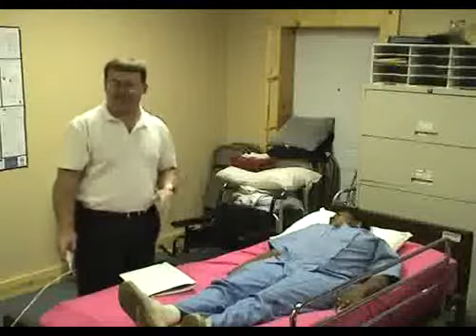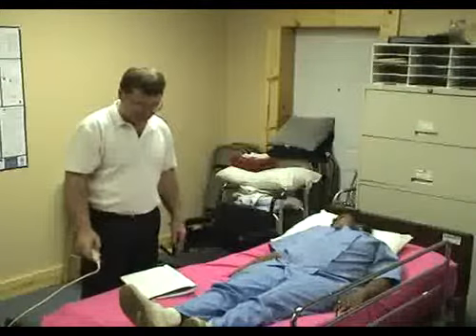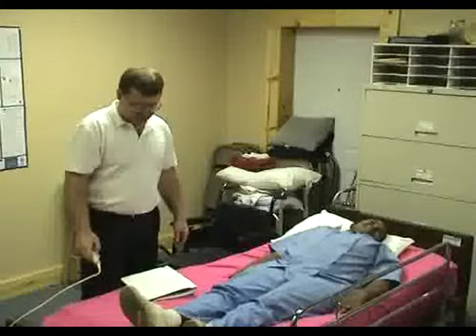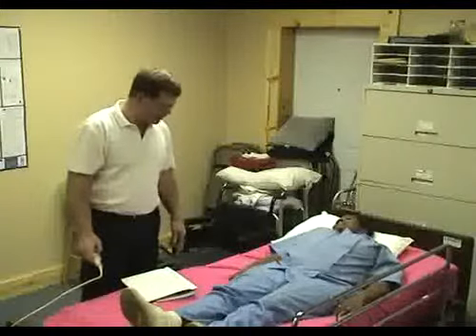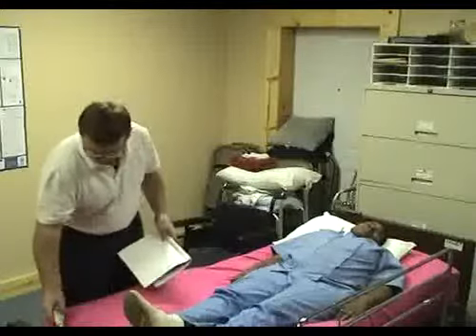Now the bed's up too high for me to be getting her in and out, so let me lower that down. Number 2. Moves client to the side of the bed next to the chair or wheelchair. Carmen already says she's paralyzed, so she ain't helping me.